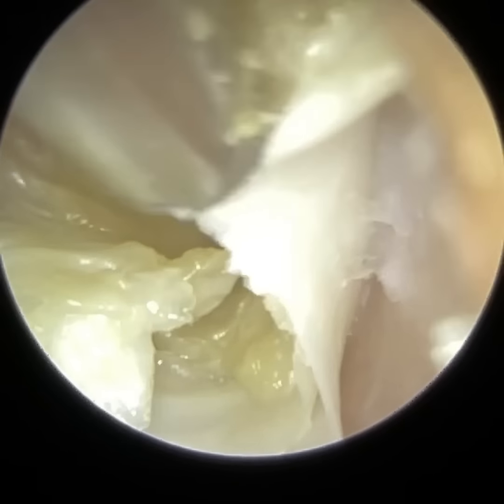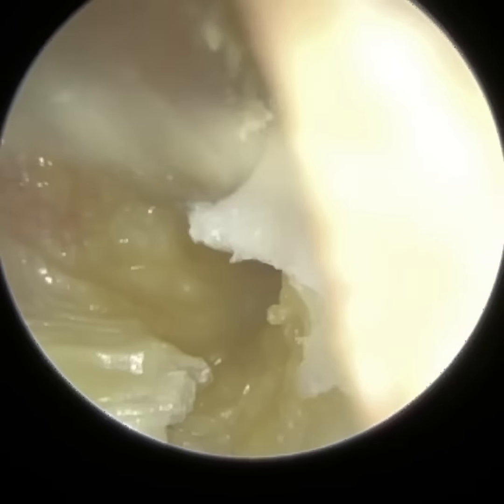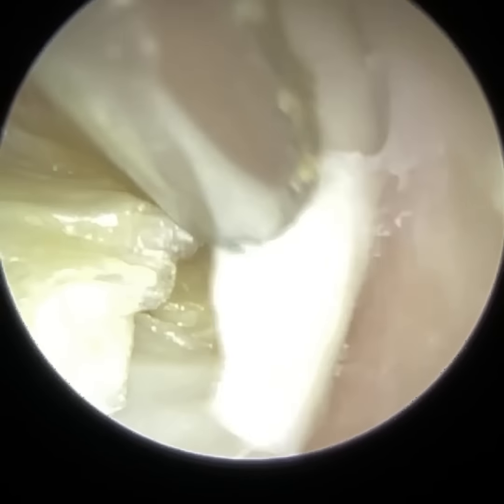There is a ventilation hole which runs through the hearing aid itself, which does allow some air, but it's a small ventilation hole. Any larger on this patient's hearing aid and it will feedback, that will whistle. So it is a difficult challenge.